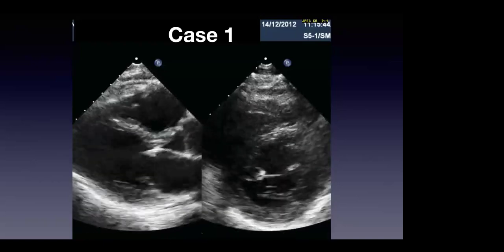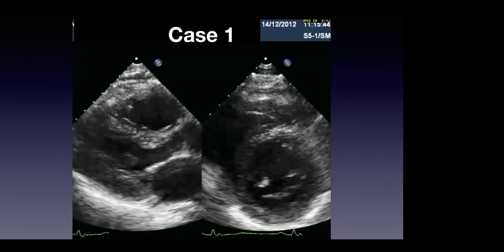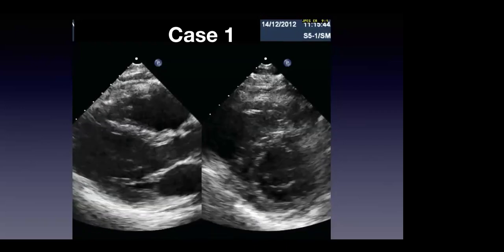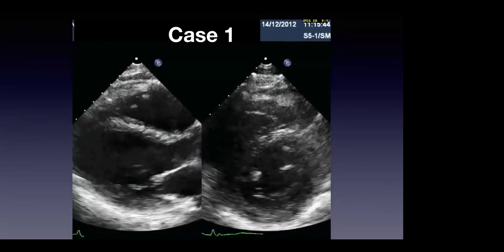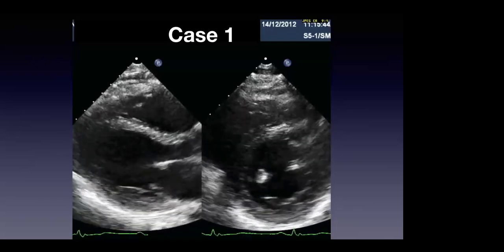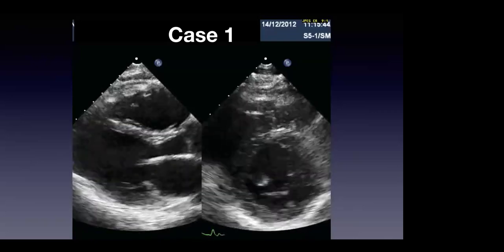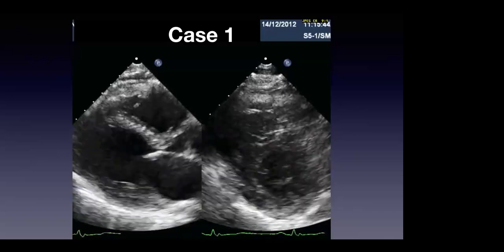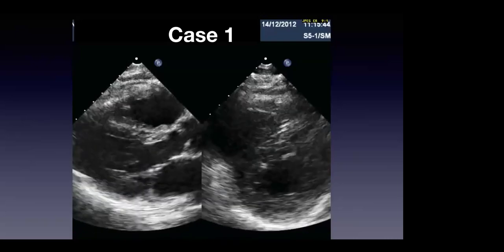Okay, so as Chris mentioned, Chris is one of our C2s. So, preserved LV systolic function, the right ventricle perhaps a little bit dilated, with maybe some hypokinesis. Obviously, you want to see it on other views. And importantly, no pericardial effusion, if you're talking about echoes in a patient with potential cardiac trauma. The one thing that's a bit unusual here is that there's something funny about the septal motion.